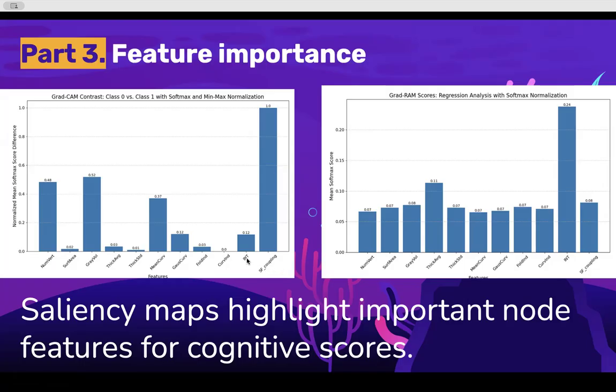And autocorrelation of fMRI isn't important, but the coupling between structural and functional connectivity is important. So, in another case, the autocorrelative property of fMRI turned out to be more important than other things.